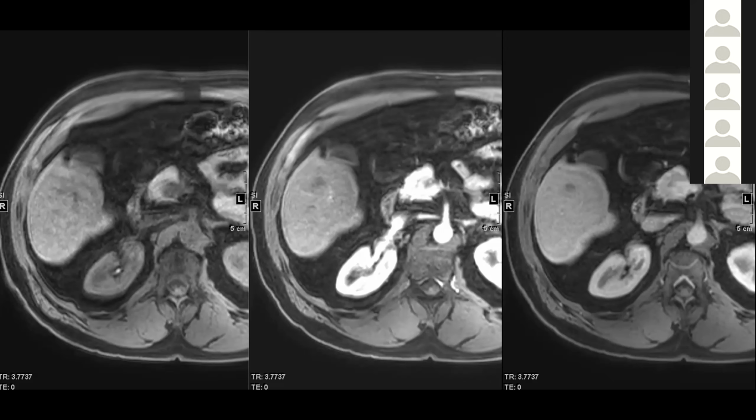So it's all great points, all fabulous points. We're still discussing it. The answer is not yet. Okay, cool. So to be clear, if you want to be precise per LI-RADS definition, this would not qualify as washout appearance, right? Because it's not iso. It has to have some enhancement on the arterial phase for washout, as the definition stands right now. And you're thinking about changing the definition because some of these hypo to more hypo actually turn out to be dysplastic nodules.